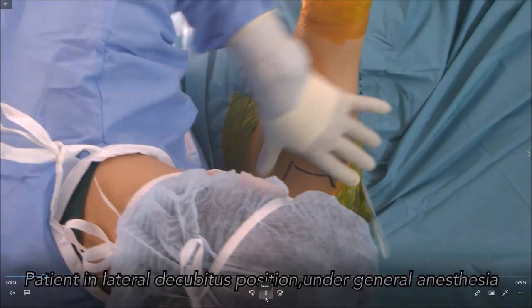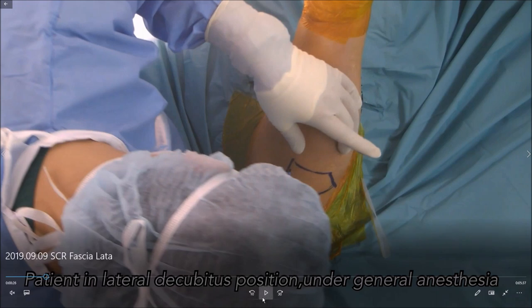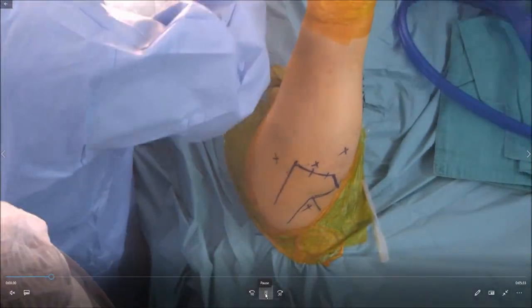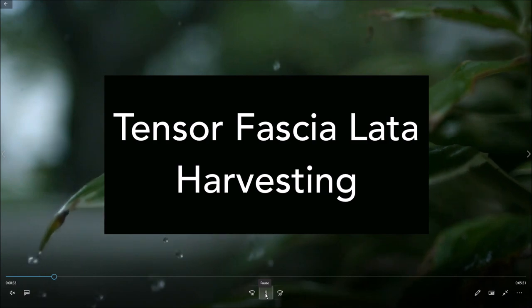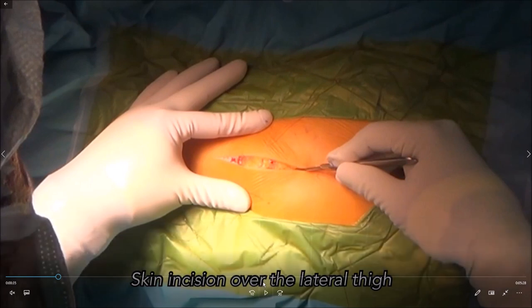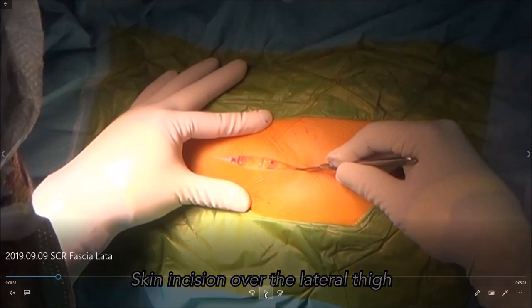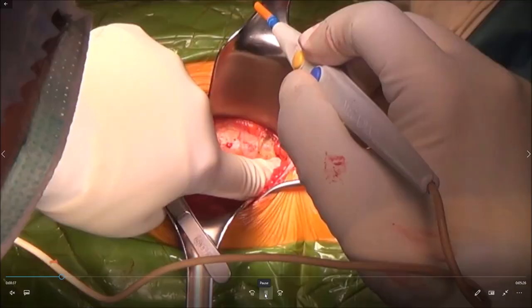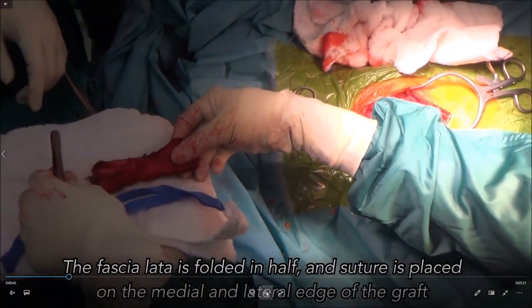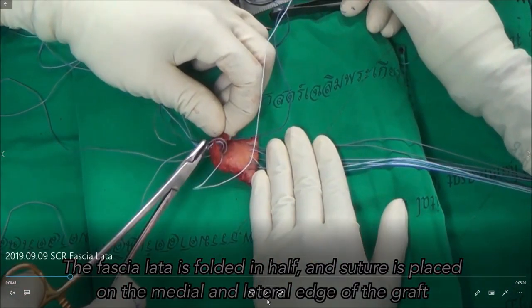This patient was done a long time ago — we used the lateral decubitus position. This position is okay but the problem is it's not easy to repair the cuff in the lateral decubitus position. First we harvest the IT band; lateral decubitus is good for that because you can easily harvest the IT band. We make the incision over the greater trochanter, identify it, and then harvest the graft.